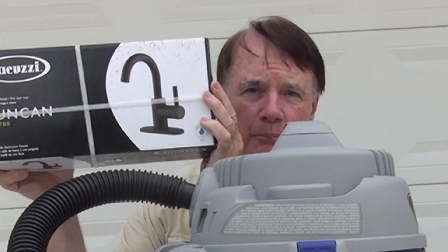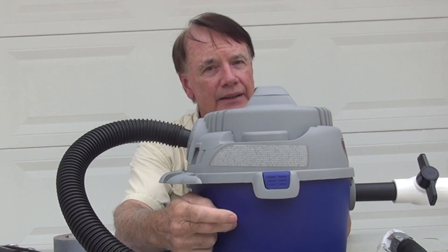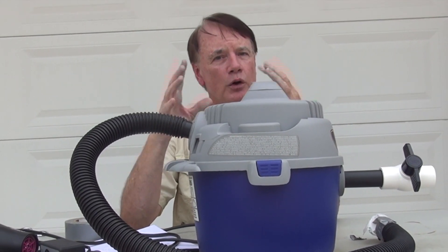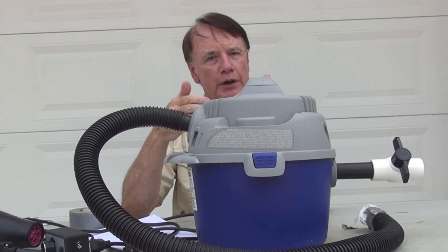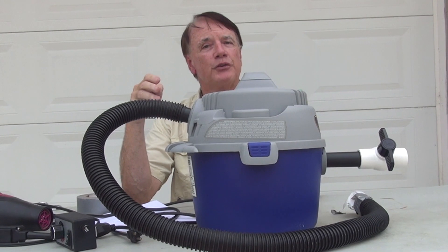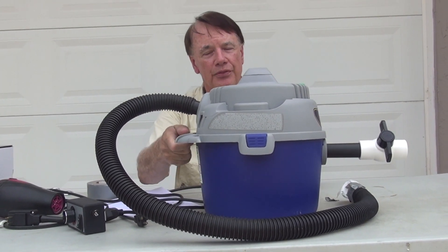The things that aren't available are the knowledge of a medical professional — how much air a person needs, what is the cycle, what is their blood oxygen level. You can take an oxygen bottle, drill a hole in here, and feed oxygen directly into the apparatus. If you need to increase the oxygen level from normal atmosphere — about 21% — up to 30%, 50%, or 100%, depending on what the medical professional determines is necessary, you can do that fairly simply with this apparatus.